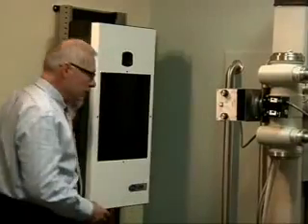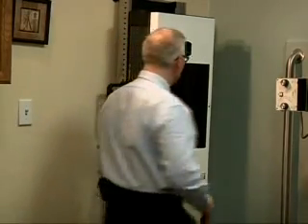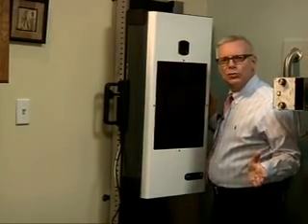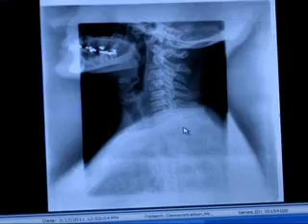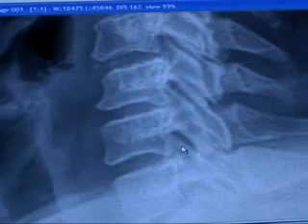Latest technology now is that they've come up with this particular device. This is a digital scanner, and just imagine that you had the highest resolution digital camera where they had 10,000 pixels on a little square, and then what we did was we magnified that into a humongous plate in which we had like 1 trillion pixels on this square. Those pixels, or that portion that picks up the image, is so condensed in its ability to enhance a visualized image that it's like nothing else before.